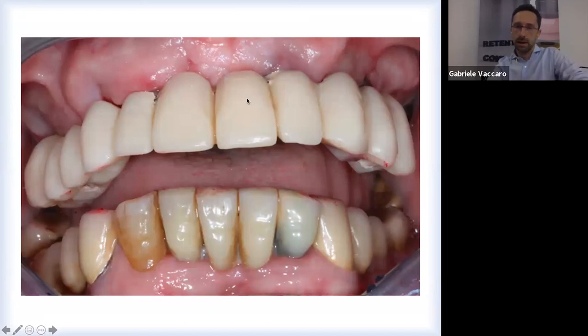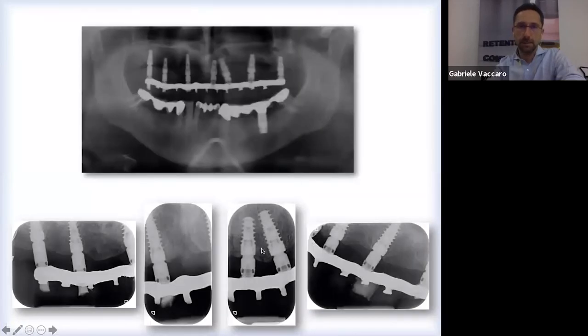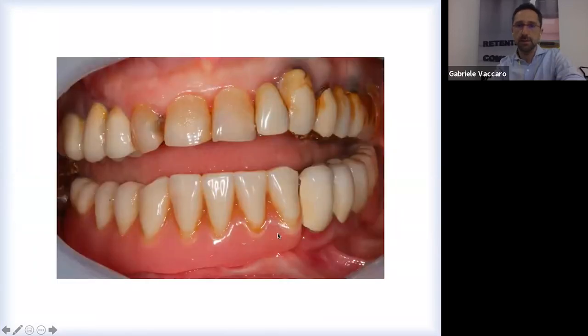This is the clinical aspect of the temporization, and this is the follow up. As you can see, I maintained the biological width. I used the one abutment one time technique and the switch platform technique. And this is the definitive solution. And this is along the time.